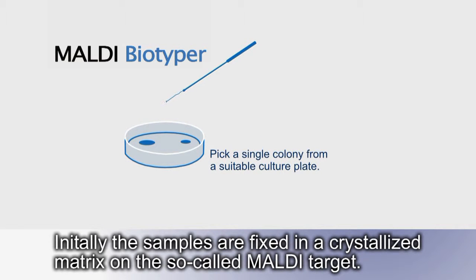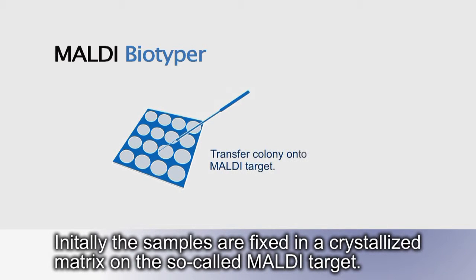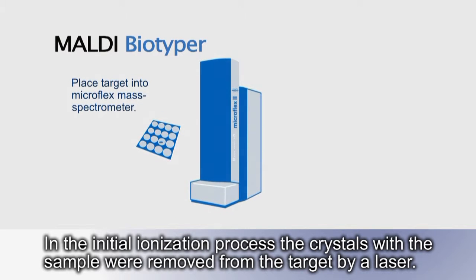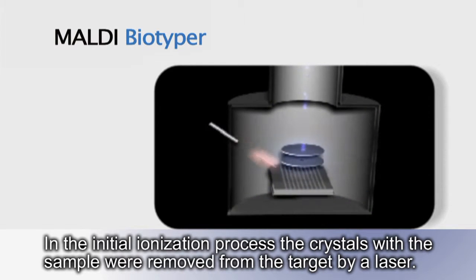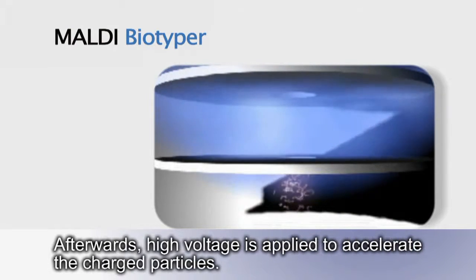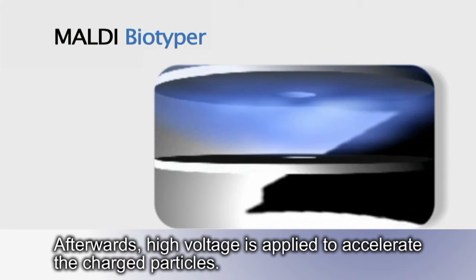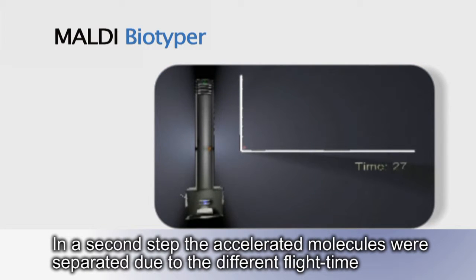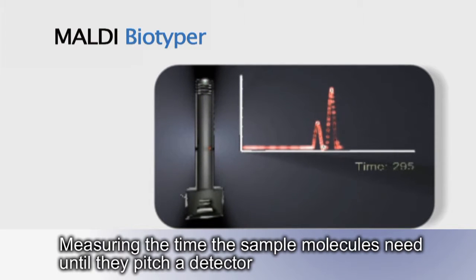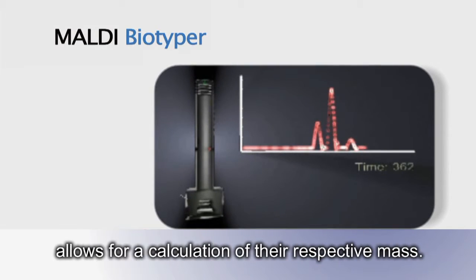Initially, the samples are fixed in a crystallized matrix on the so-called Maldi target. In the initial ionization process, the crystals with the sample are removed from the target by a laser. The sample molecules are vaporized into the vacuum. Afterwards, high voltage is applied to accelerate the charged particles. In a second step, the accelerated molecules are separated due to the different flight time they need, depending on their mass, for a certain distance. Measuring the time the sample molecules need until they hit a detector allows for a calculation of their respective mass.